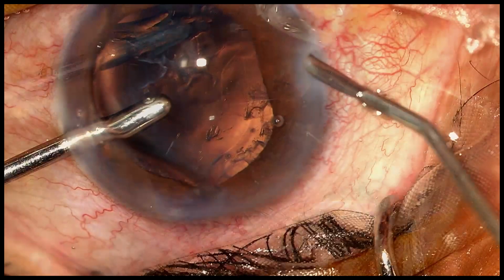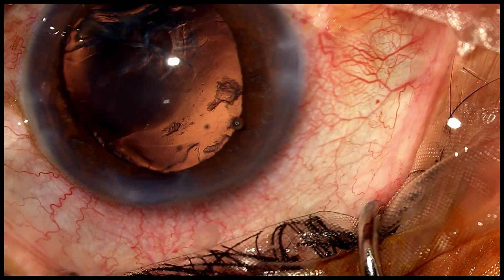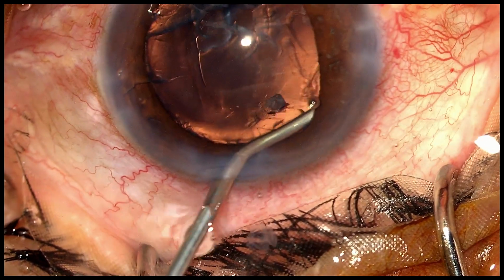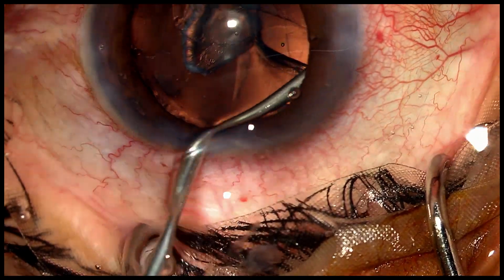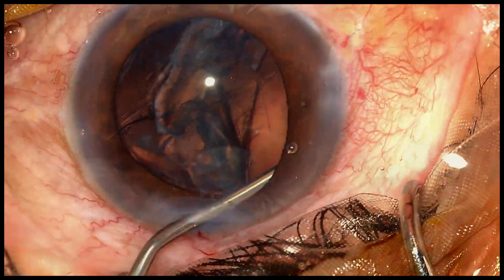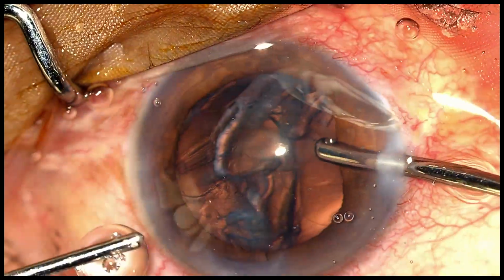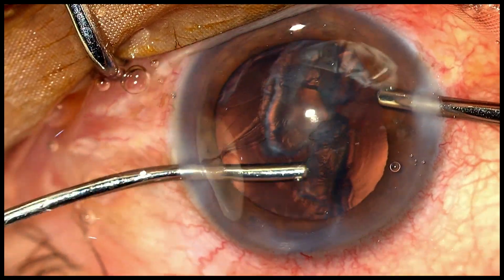Having removed as much of the cortex and the epinucleus as I could, I then perform a viscofluid exchange. I'm going to now attempt a viscodissection of the superior epinucleus. Having managed to prolapse the epinucleus towards the center, I now proceed to aspirate it.